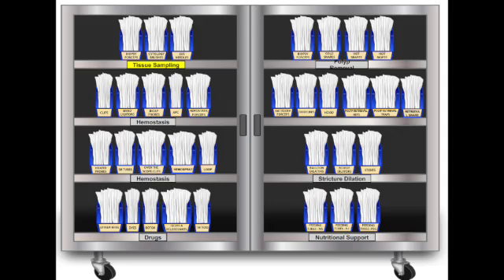So visualization's covered, dyes are applied. Next step is often getting tissue samples. Let's talk cytology brush. I hear there's a key difference in types depending on the procedure. Absolutely. Two main types. There's the regular brush, goes through a standard EGD scope, simple. Okay. Then there's a specialized one that needs a guide wire. That's specifically for ERCP procedures for brushing inside the bile duct. Gotcha. And what are we using them for generally?